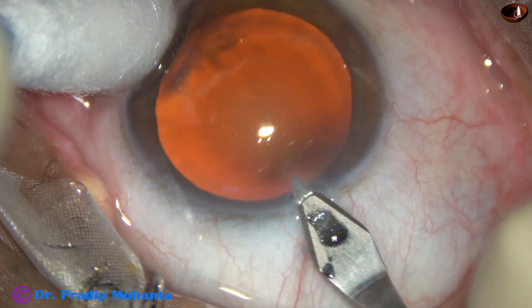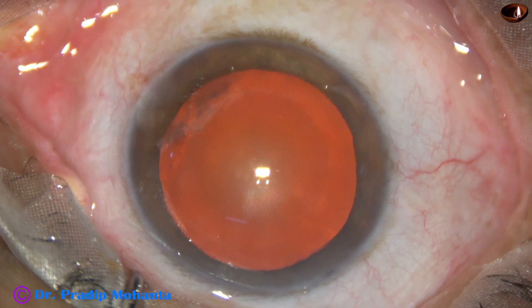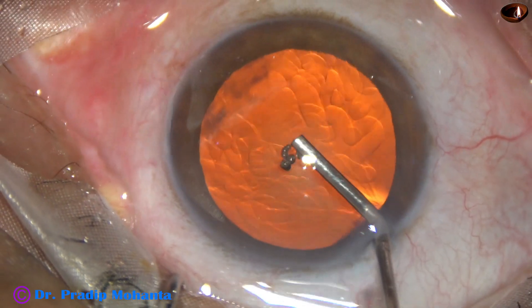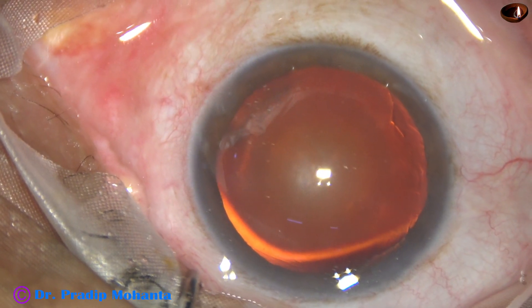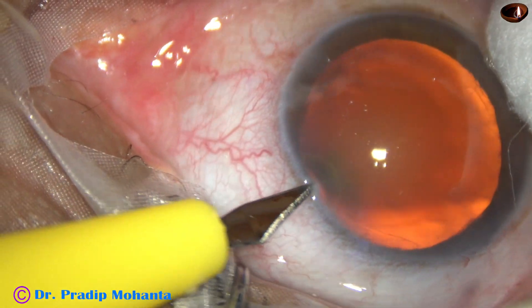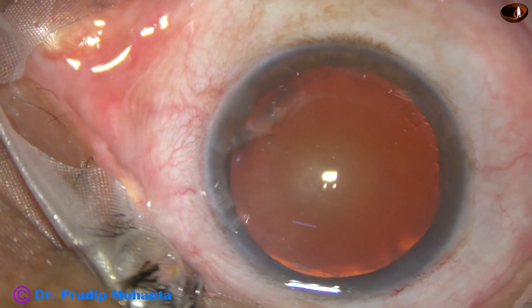This is the main incision with a 2.8 millimeter steel keratome at around 11:30 o'clock. The anterior chamber is filled up with viscoelastic substance — this is 2% hydroxypropylmethylcellulose, which is widely used in India, Bangladesh, Nepal, and many other countries.